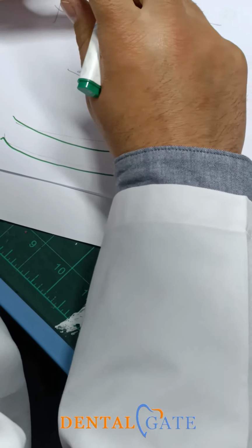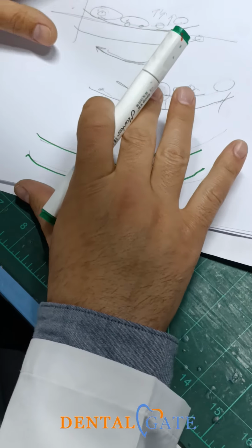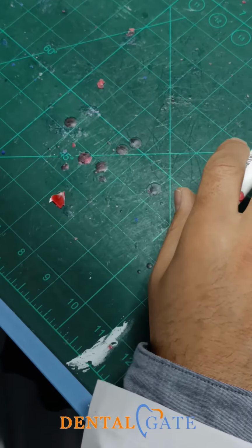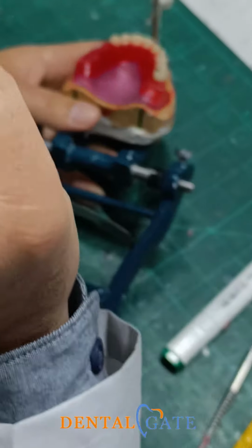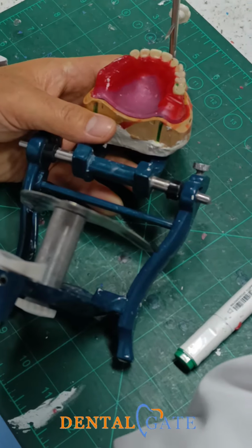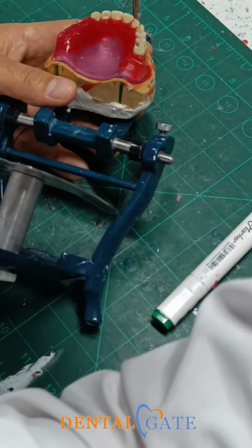It is very mandatory. Because if you make a mistake with the 6 regarding the tilting, there is no way for the 7. The lower teeth should follow the normal occlusion, and the normal occlusion cannot be accomplished without this criteria. So don't make any touching to the cusps, but regarding the tilting plane, this is mandatory. If you don't make it with the 6, that's a mistake. But with the 7, this is a horrible mistake.